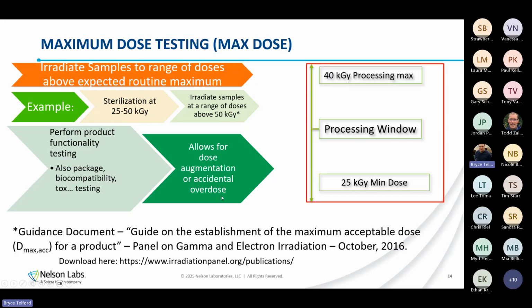When we're talking about our minimum dose or our sterilization dose, that is the minimum amount of radiation required for the product to be considered sterile. So that's basically our floor. That's the minimum that we need.